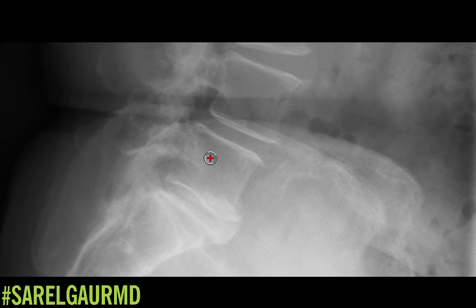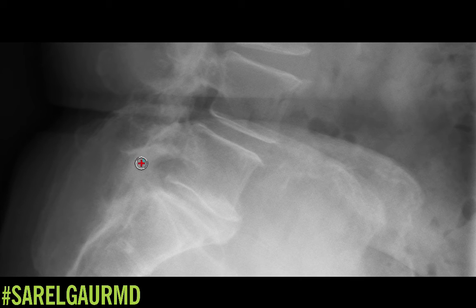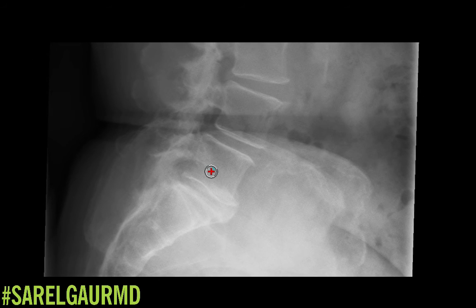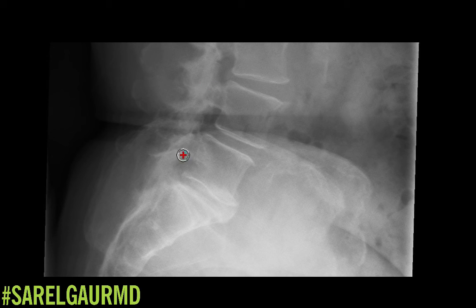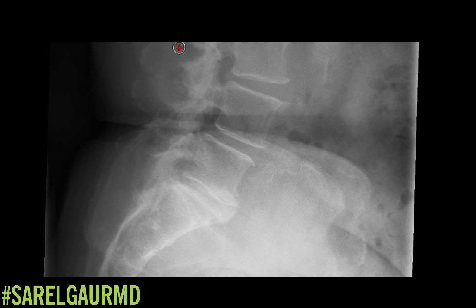Now at the cone-down L5-S1 view: again, at least moderate height loss here with an anterior disc osteophyte complex. As for spondylolysis at L5, I would say I'm not definitively seeing it. So this pretty much concludes my search pattern. For this spine: there's anterolisthesis at L4-L5, minimal, and I'll give millimeters. Mild to moderate multilevel disc disease. Definitely some multilevel facet arthrosis in the lower lumbar spine. May have spinal canal stenosis — I'd recommend considering MRI for further evaluation of the central canal and neural canals. Baastrup's disease is also worth mentioning as it could be limiting movement. I might also note limitations: the pedicles aren't seen that well, and if there's high concern for metastatic disease, an MRI or other workup could help exclude that.